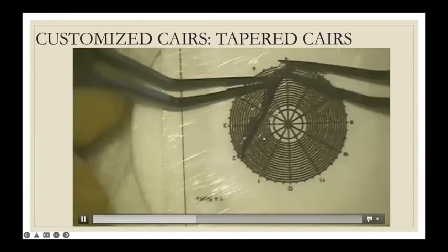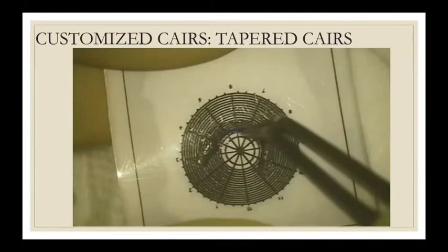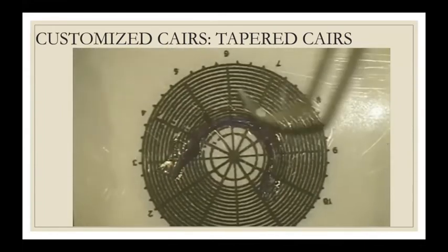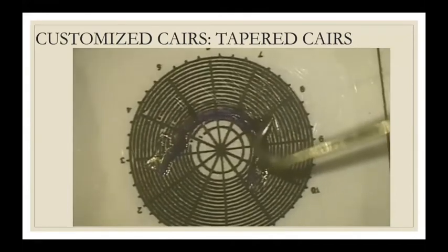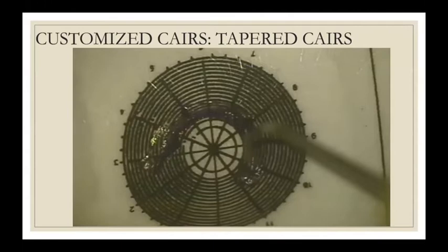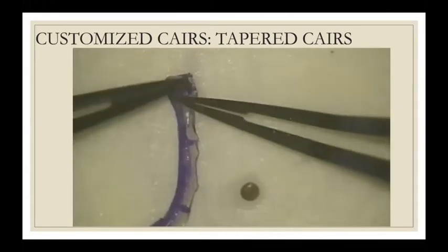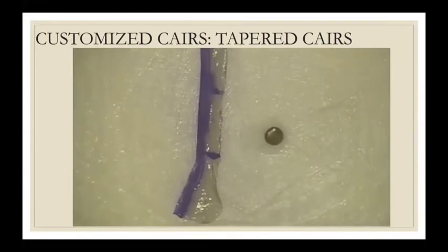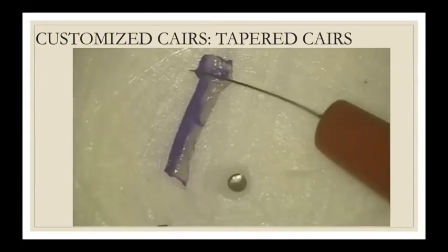By now, I've designed a good range of instruments that help you do this much more predictably and repeatably. So this is a degree zone marker that I've created for doing the surgery, so that you don't have to put the CAIRS segment in and wonder if that's the correct size. Instead, you can plan according to the topography preoperatively, mark on the clock hour and the optic zone that you want, so that you can cut exactly precisely to the correct desired arc length of the segment here.